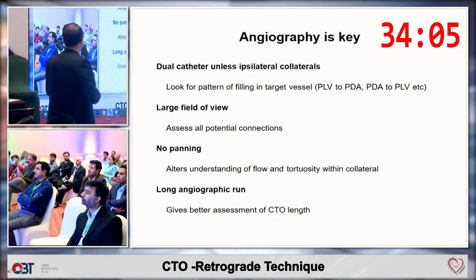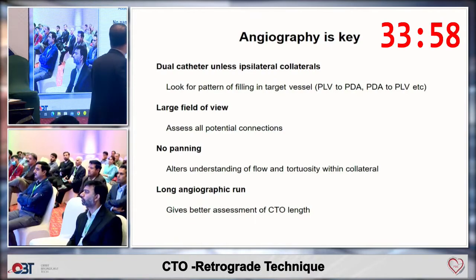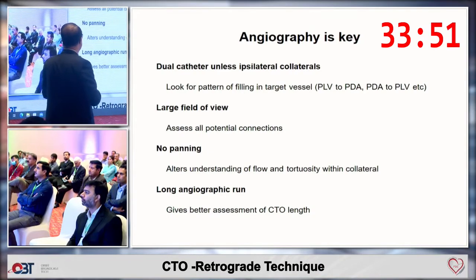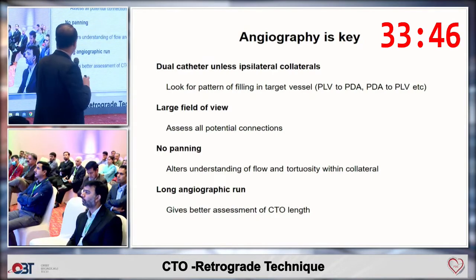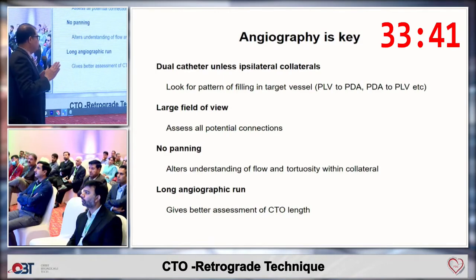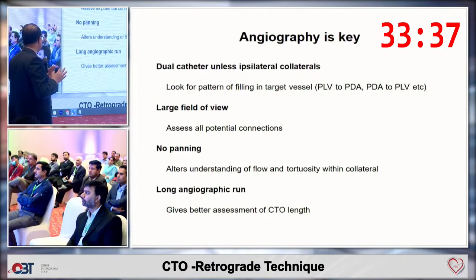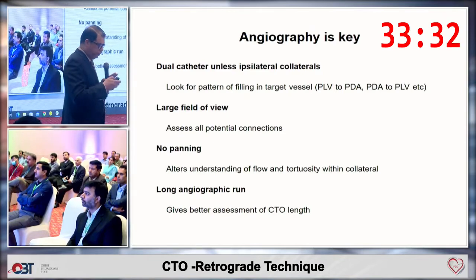So dual catheter injection is almost mandatory. Only in cases in which you have ipsilateral collaterals do you not need dual catheter injections, but 99.9% of the time, you need dual catheter injections with guides in both the antegrade and the retrograde systems. You should take an unmagnified view so you can see all the collaterals. There should be no panning, and there should be long runs so you can see all the collaterals filling.